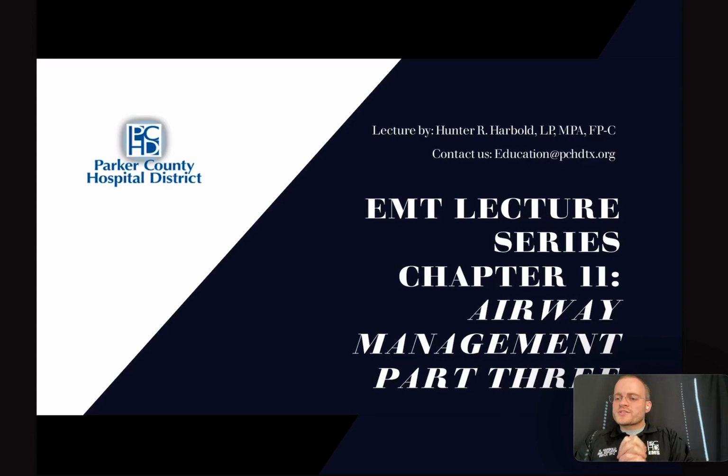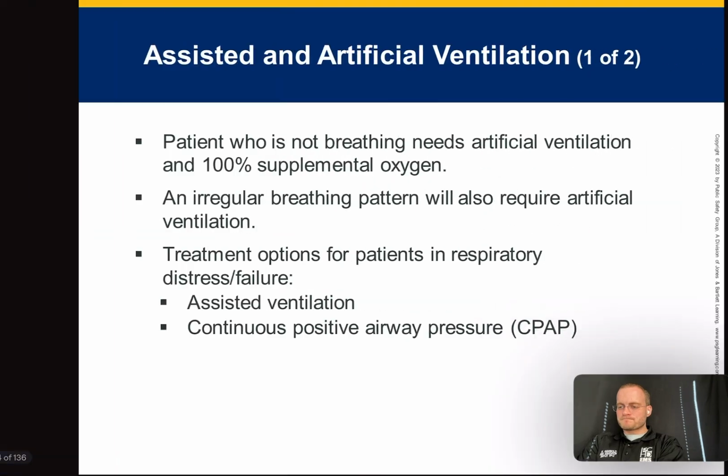All right, everyone. So we'll go ahead and start on the last part of this chapter 11, airway management. This last part talks about some of the tools in our toolbox beyond nasal cannulas and non-rebreathers and stuff like that. So let's talk about that.